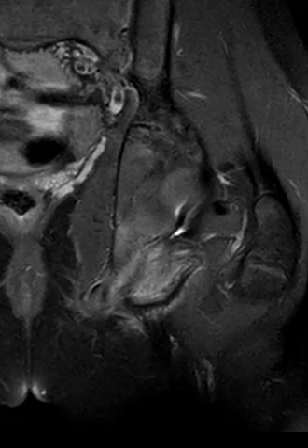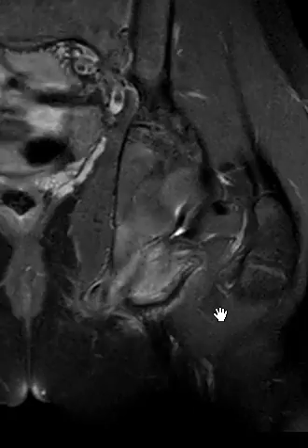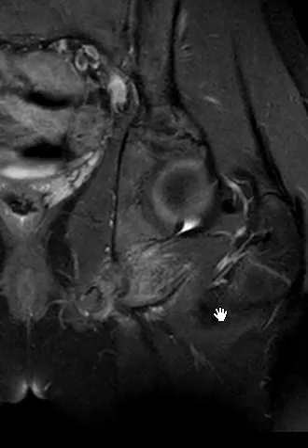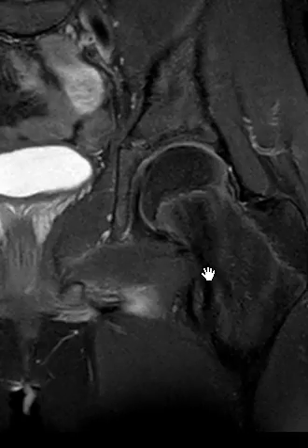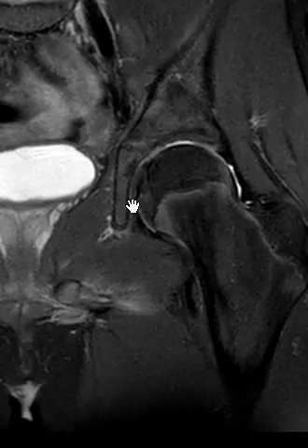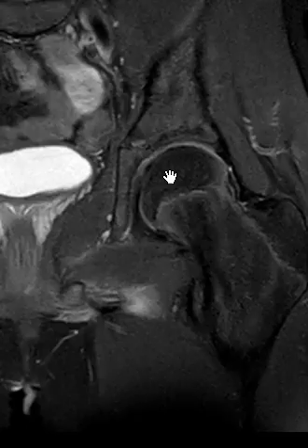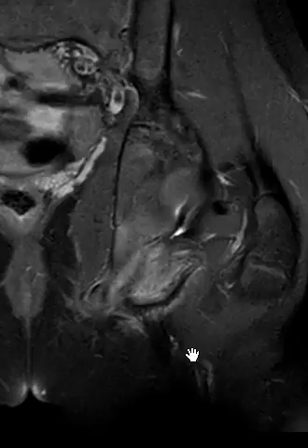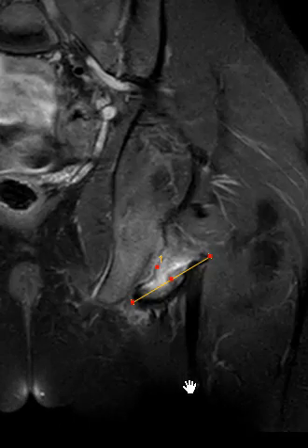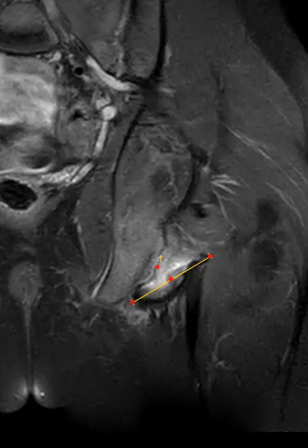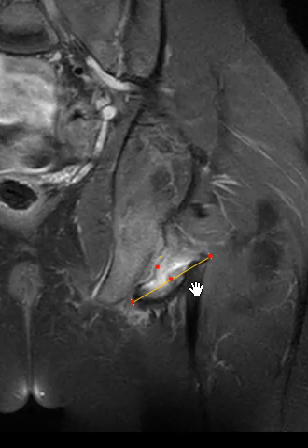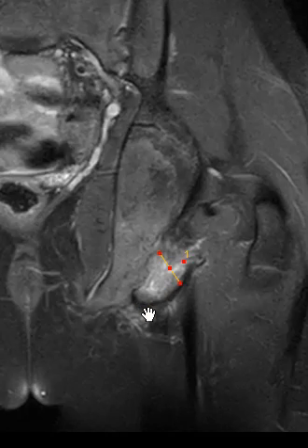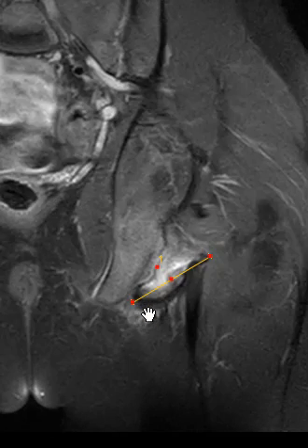They have pain in the hamstring region. We have a coronal PD fat-saturated image here that shows the left hip to be normal. If we look down below the hip, we look for the hamstring tendon — this is part of the hamstring tendon here coming up and attaching. I have a marker here on an avulsion fracture.